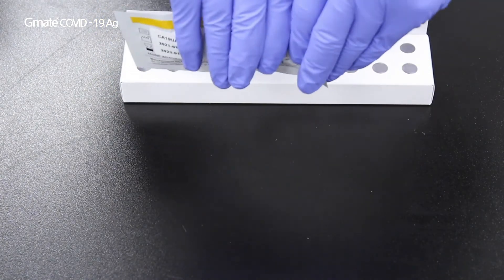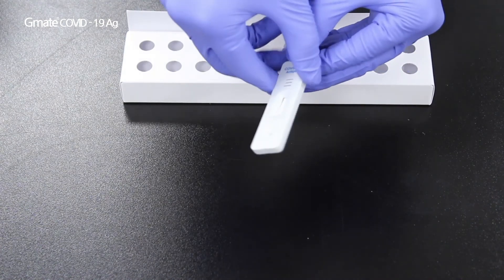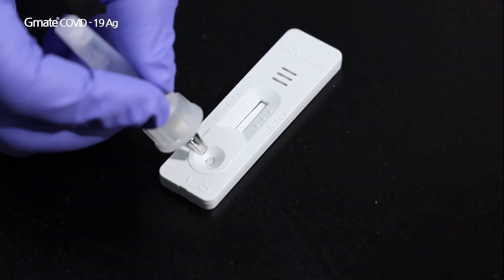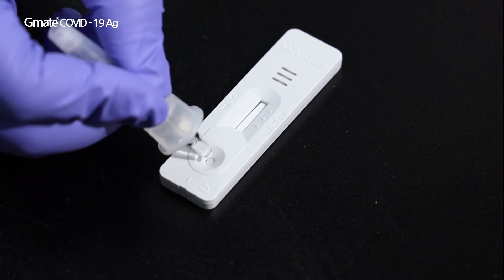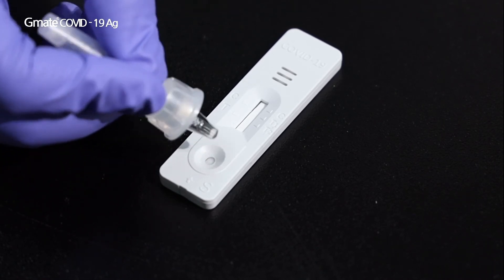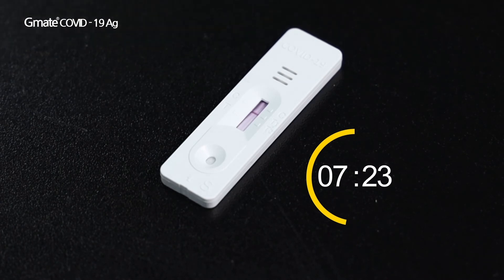Open the test device foil pouch and place the test device on a flat and clean surface. Apply 2–3 drops of the treated sample extract vertically into the sample well of the test device. Wait 15 minutes and check the test result. The test result is not valid after 20 minutes.